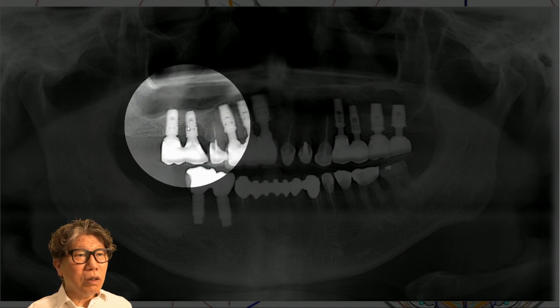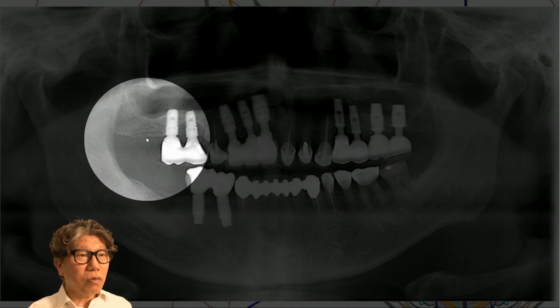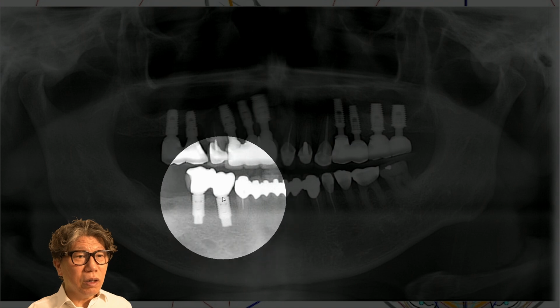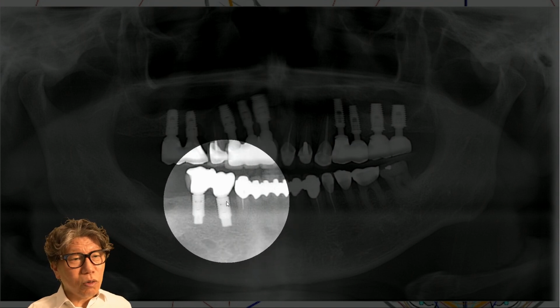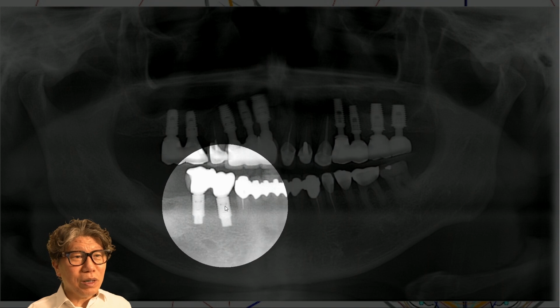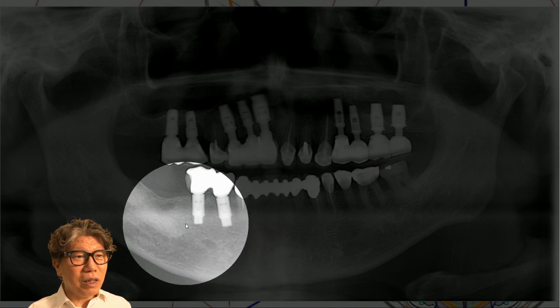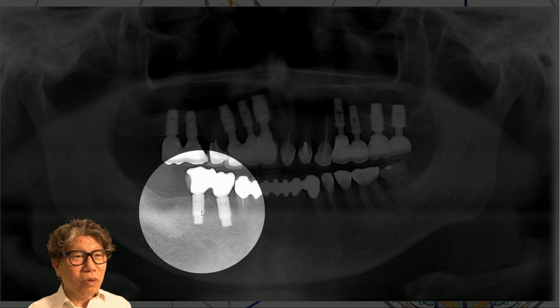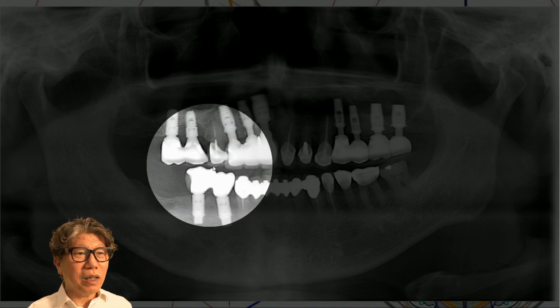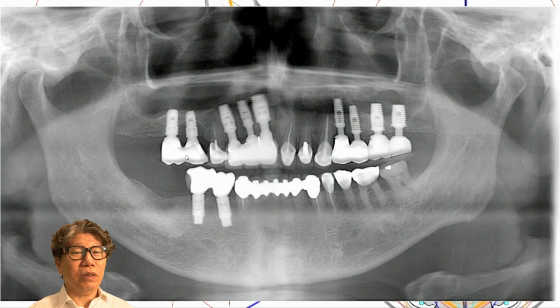Here you can see, this is the premolar, here is the second premolar, and next is a molar. I skipped the end. It's funnier here. Here is the canine. We call the first premolar the number 4, and the second premolar the number 5. However, if you look here, the diameter is 4.5 millimeter. This first molar is referred to as number 6. Diameter 5.5 millimeter. So, the back part doesn't touch, and only this part continues to make contact. Eventually, it is a structure where the bone cannot help but resorb.